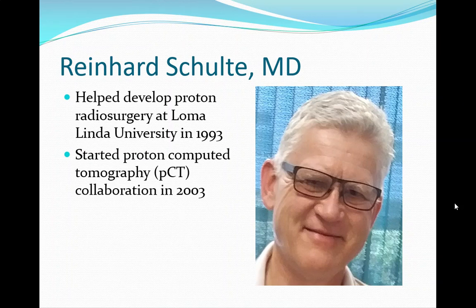And he quickly noticed this depth problem. And so he's trying to figure out, okay, how do I fix it? And there's a problem with the X-ray conversion right around water. There's a big uncertainty range where your tissues are around water. Aside from your bones, right? Most of it's hovering right at water, and that's where the biggest uncertainty is.